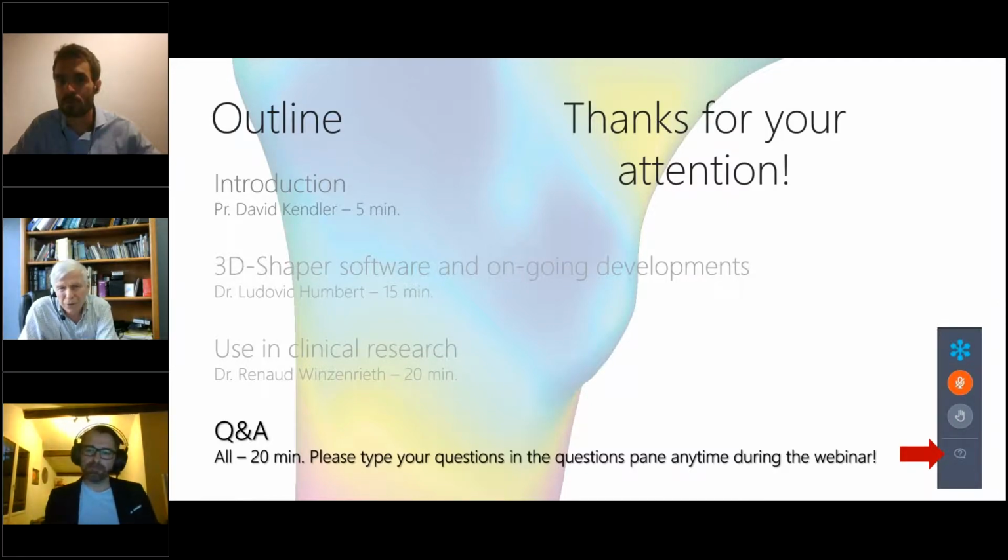Okay, very good. Now we have a question for Renaud. I'm sorry, Renaud, you had a comment. In terms of absolute value, we have this standardization, but for the precision overall, we have more or less the same precision in Hologic and GE in terms of relationship with the QCT parameters.